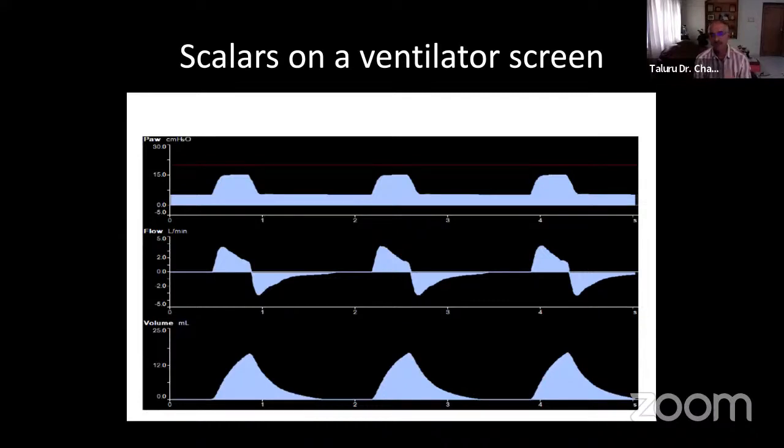Which is the flow time scalar? First question. Which is the flow time scalar? Two. Is it a decelerating kind of a flow or a square flow?